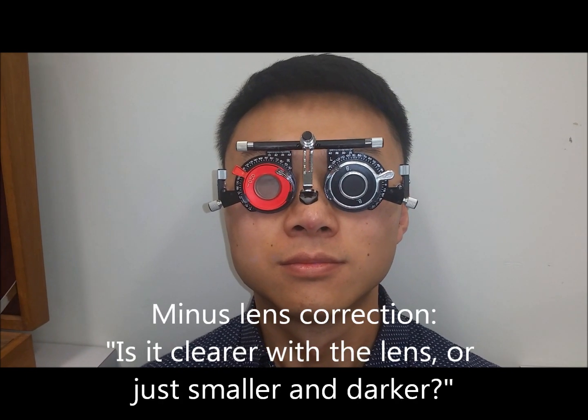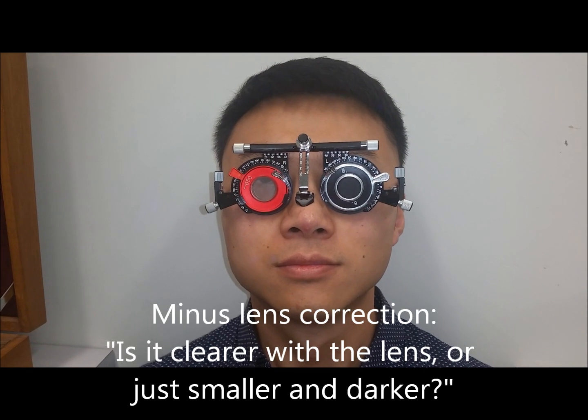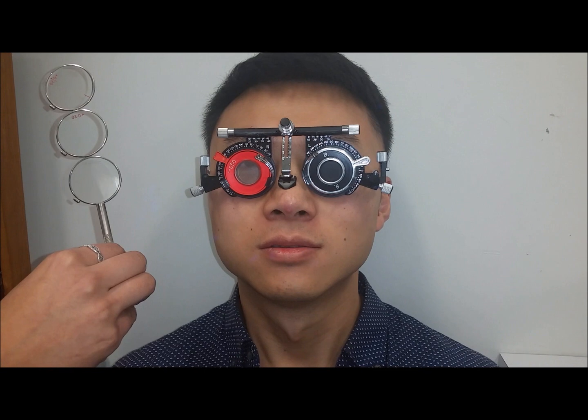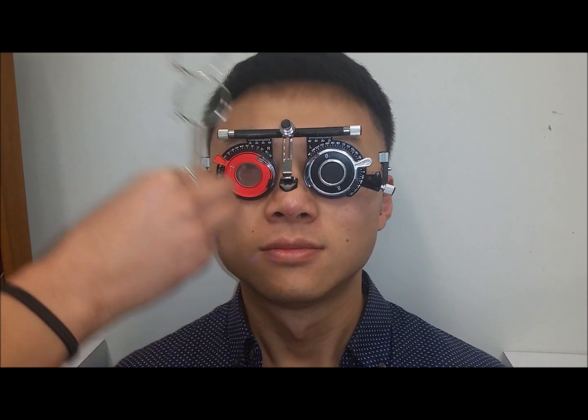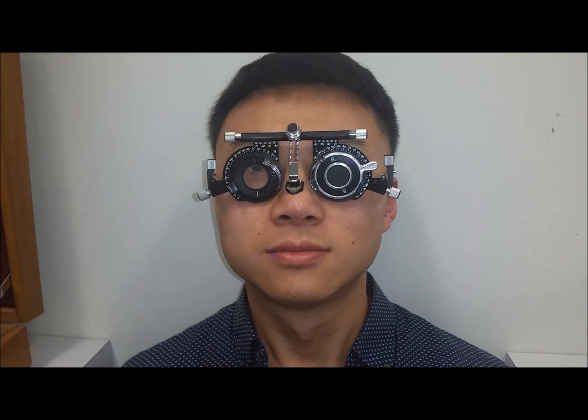With minus lens correction, it is crucial that the orthoptist asks the patient if they are actually seeing the letter clearer or if it is just smaller and darker. So I'm just going to get you to do the same thing for me. Tell me if it's clearer with or without, or is it just smaller and darker? Clear with. The orthoptist replaces the minus 0.5 lens with a minus 1 lens. This process continues until the patient states that their visual acuity is the same or the letter is just smaller and darker with the extra lens power.